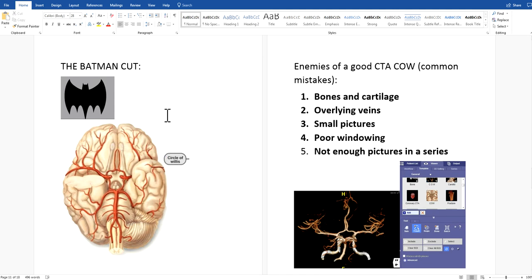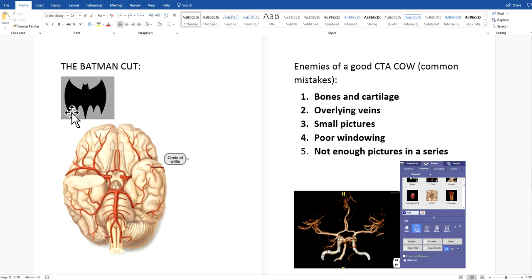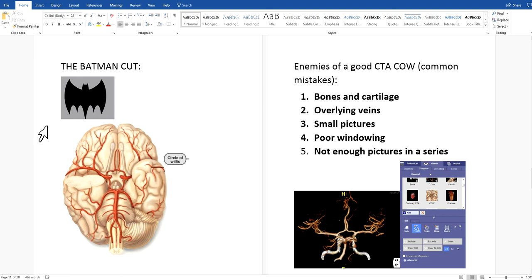Another cut is called the Batman cut. I call it the Batman cut because you come in and cut the anterior cerebrals, middle cerebrals, and posteriors, and you end up with a cut that looks like Batman. So you come in here and go around everything, then come back around to the outside, let it go, and remove everything.